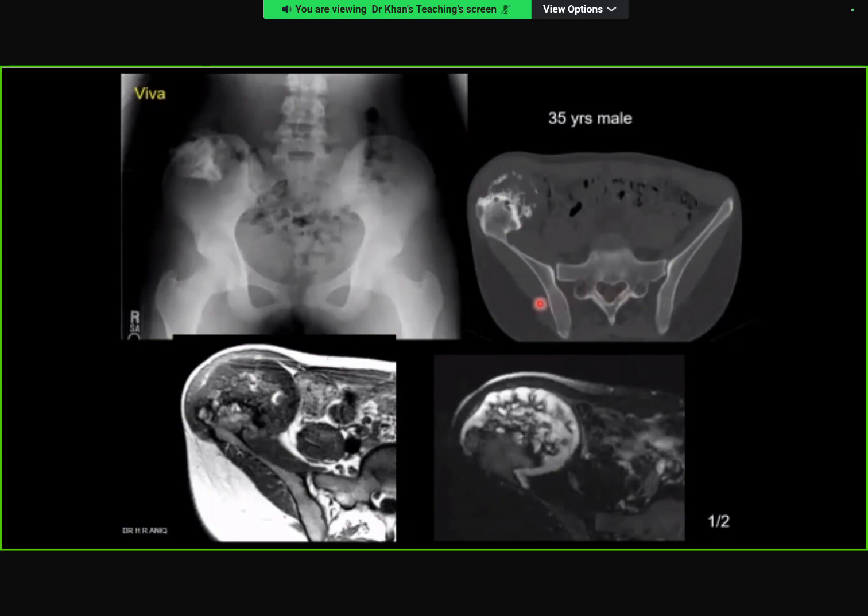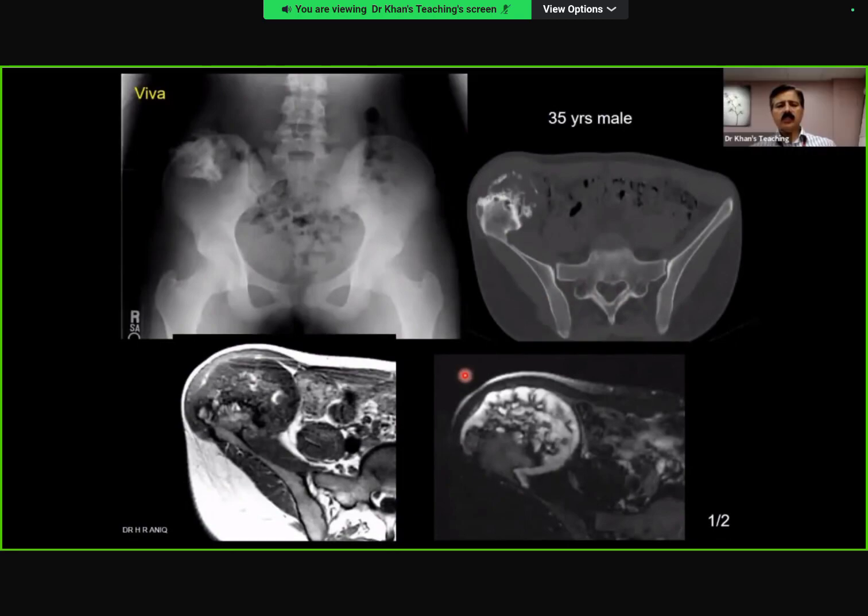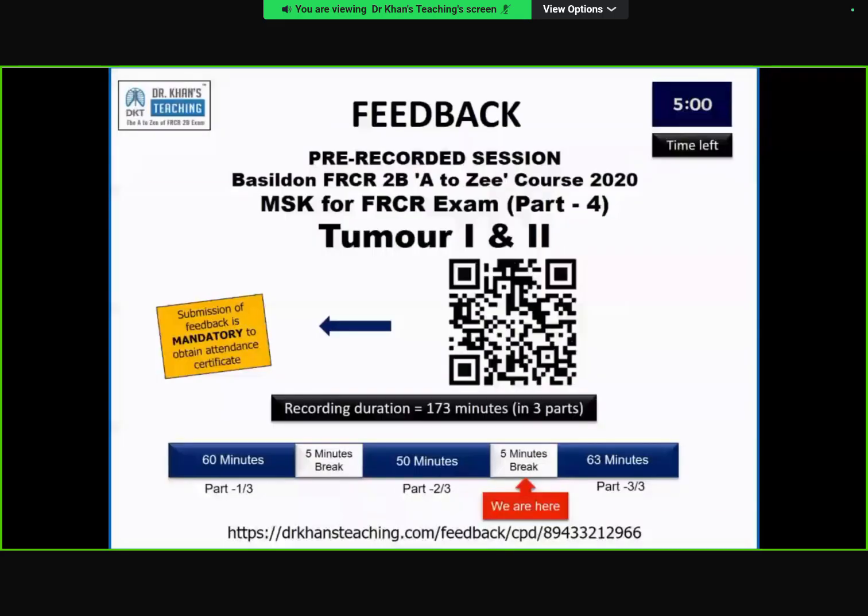Now, this kind of a case, because of time factor, I put it together. But just a recap, the examiner is going to show this to you, and you will pick up an osteochondroma, and the leading thing might be that there is a bit of pain. CT has got nil role. Don't ask for a CT, right? Ask for a MR. And on MR, this cartilage cap is thickened, means malignant transformation, means bone tumor center referral. So these kinds of cases have come in the exam again and again.